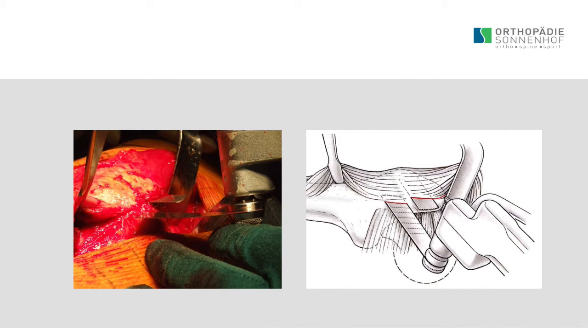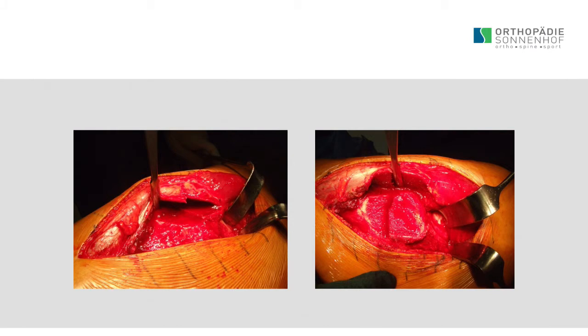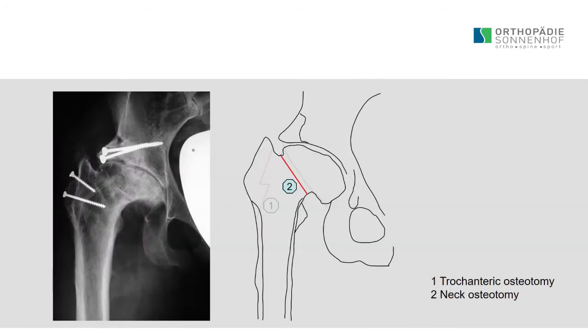If you do a total hip, you can even make your step quite bigger, and when you then use a chisel, you will have a nice step that allows a good, stable fixation and good orientation. If needed, you can do proximalization in addition, but you can also do a distalization. If you take out bone from the trochanteric area, you can add it, and then you will have a distalization of the trochanter. So that's our approach. Then we do the neck osteotomy when we have dislocated the hip.